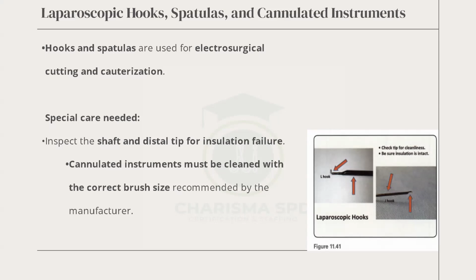They have channels. Check the tips, flush the channels, and make sure they are good to go. These two items are also powered using electricity. Next slide.